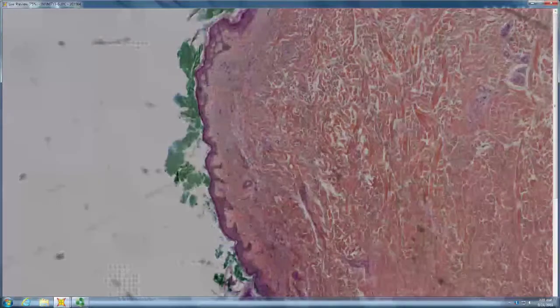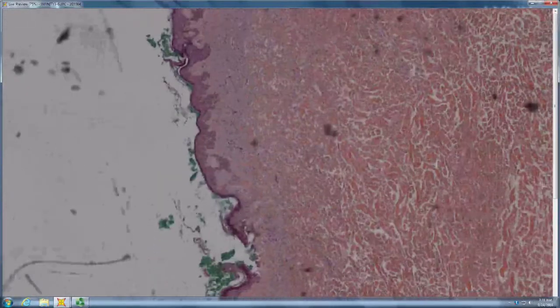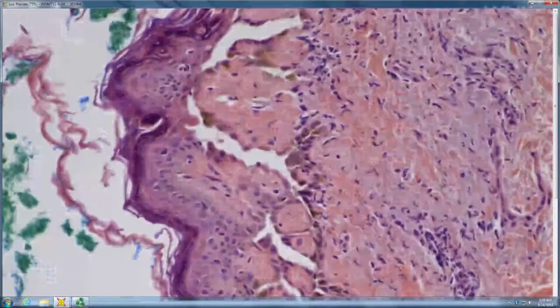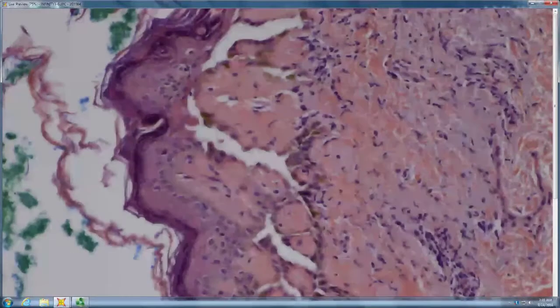And then depending on the varying degrees of acantholysis and dyskeratosis, it can look very, very similar to EM histologically. Often the acantholysis is minimal and the dyskeratosis and necrosis predominates.